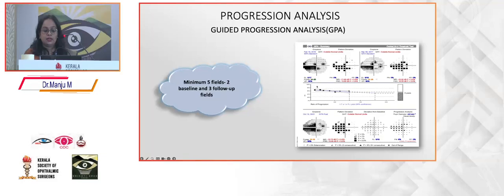So the visual field index is there, the mean deviation is there, it is all written, and you can do progression analysis either by the visual field index or the mean deviation. The visual field index of all the visits will be recorded, and the machine can extrapolate this data over 5 years and tell us, if the patient is having the same rate of progression, what the patient's visual field index can be after 5 years.